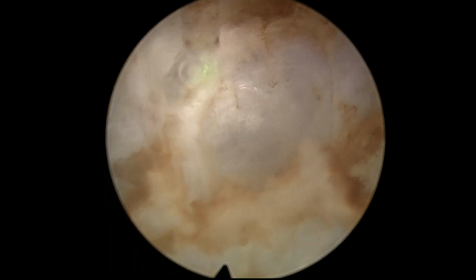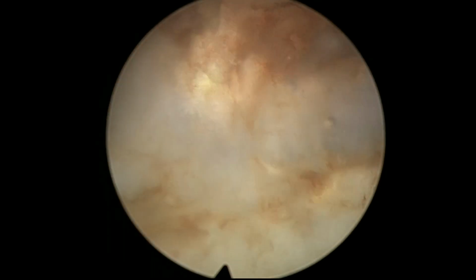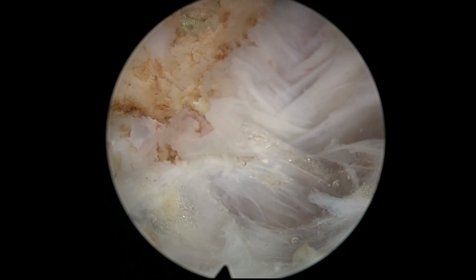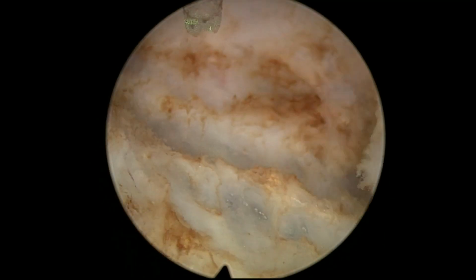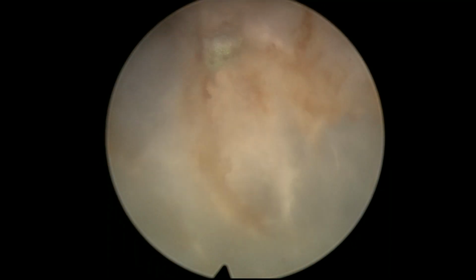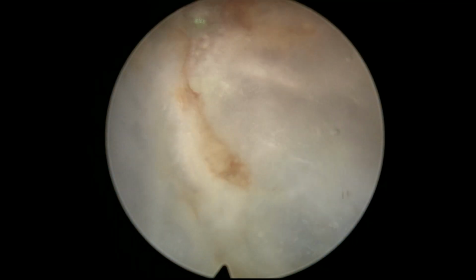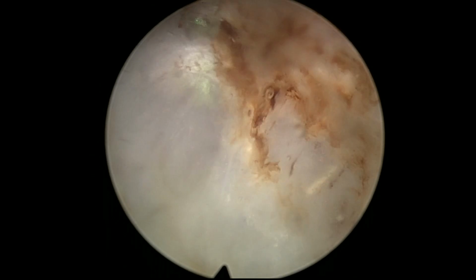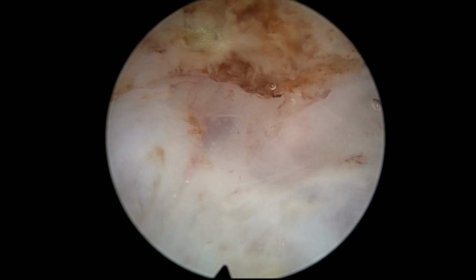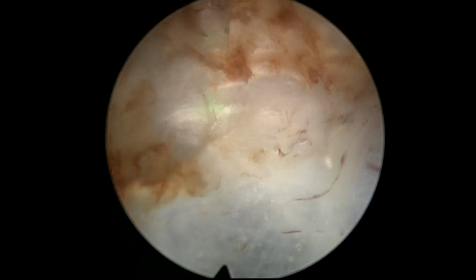And then overall, I think there is a clinical impression. I always say, because people let me try a laser and they say, "What do you think?" And I say, "I don't know. I have to do hundreds of cases to start grasping the reality, the final balance, or the final opinion, because it's not easy." Often some prostates are much easier to operate. The planes are much more evident, tissue quality is very good, and you might think, wow, the laser is so good, but it was actually the case that gave you a lot of help, because the patient was sympathetic with you, had a nice sympathetic prostate, as I usually say.